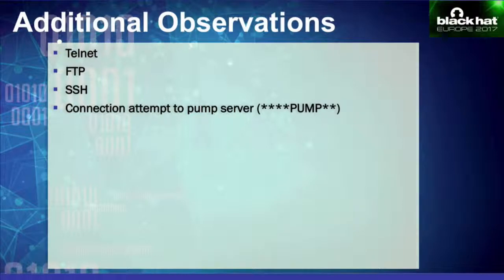So it was trying to resolve a NetBIOS name, which wasn't there. We figured that because Infusion Pumps usually talk to the pump server, it was talking to the pump server. At this point in time, we didn't have a pump server on our lab network, so we just spun up a virtual machine, gave it the same NetBIOS name that the pump was trying to resolve, and put it up on the network.